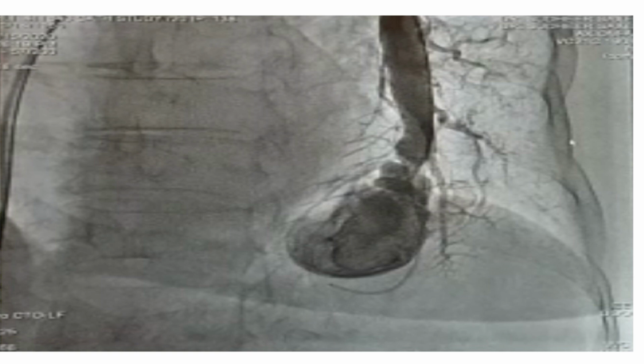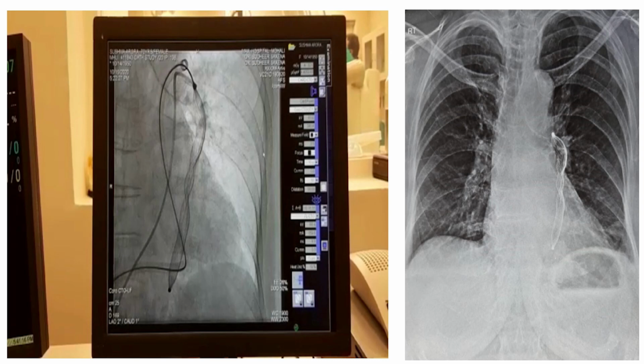Then Dr. Sudhir thought of putting an ASD device. It was actually a very rare anomaly. It's an LPA to LA, so a massive shunt. Likely to be congenital, but it only came to the fore because of the COVID. In the literature, we have not found another case. It happens in children sometimes, not in adults. But it was a massive thing.